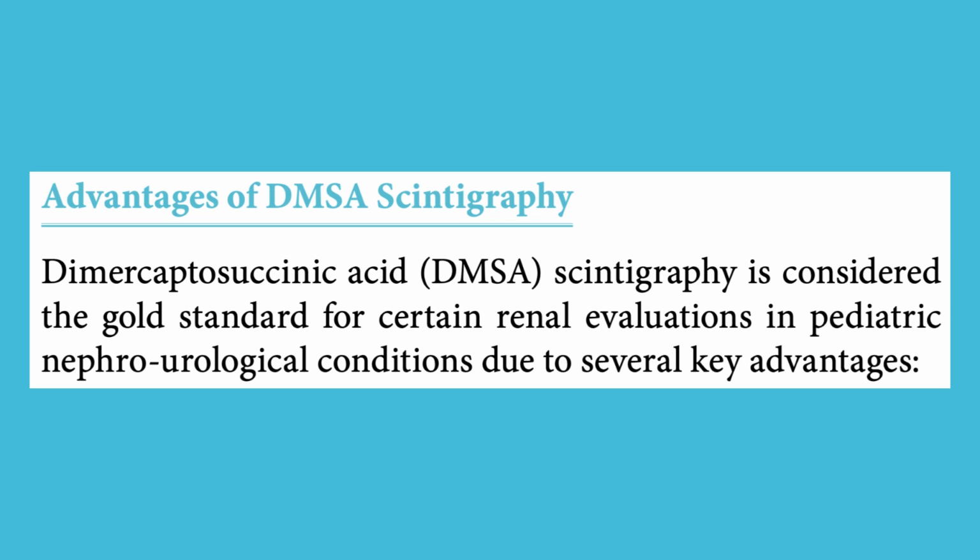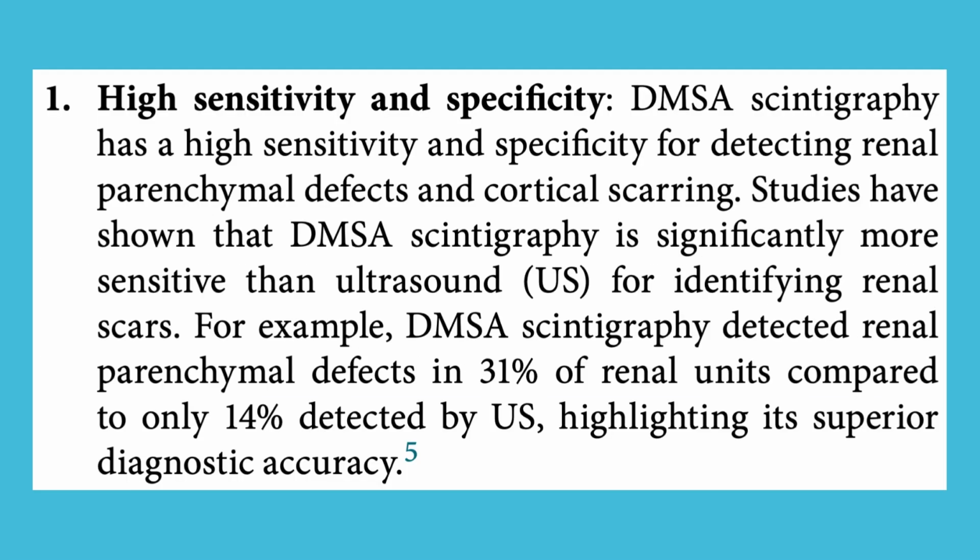Advantages of DMSA scintigraphy. Dimercaptosuccinic acid, DMSA, scintigraphy is considered the gold standard for certain renal evaluations in pediatric nephrourological conditions due to several key advantages. 1. High sensitivity and specificity. DMSA scintigraphy has a high sensitivity and specificity for detecting renal parenchymal defects and cortical scarring. Studies have shown that DMSA scintigraphy is significantly more sensitive than ultrasound, US, for identifying renal scars. For example, DMSA scintigraphy detected renal parenchymal defects in 31% of renal units compared to only 14% detected by US, highlighting its superior diagnostic accuracy.